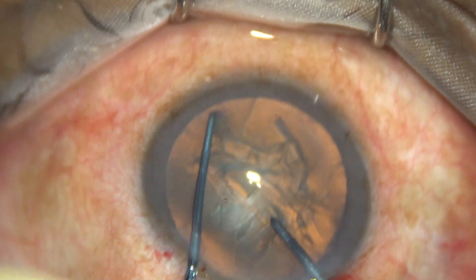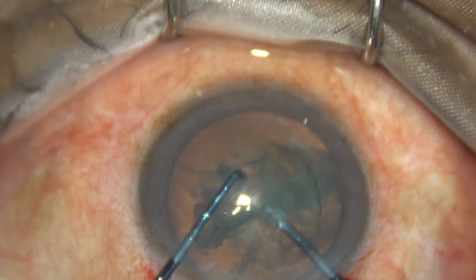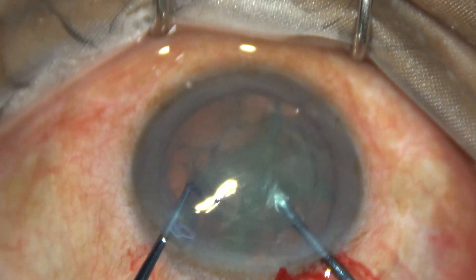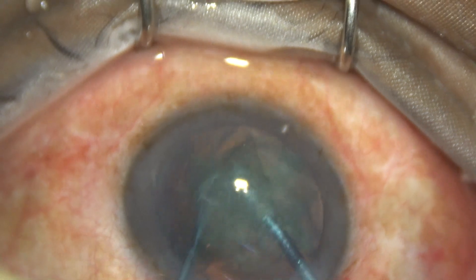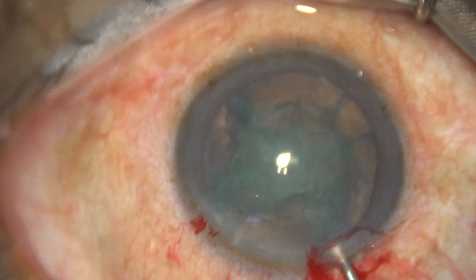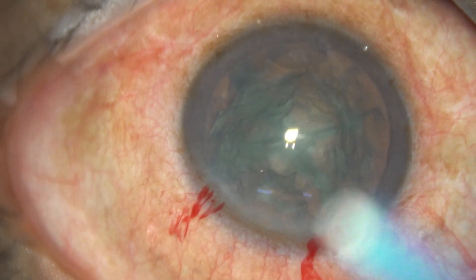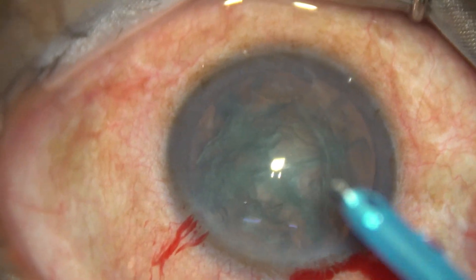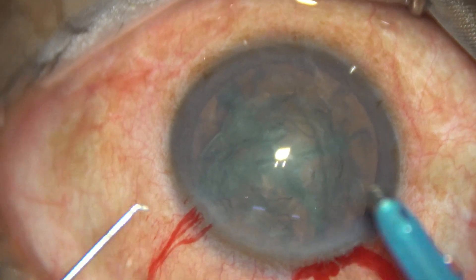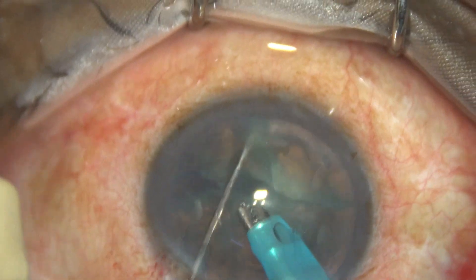The Prechopper is engaged just in front of the main wound in the soft part of the nucleus. The sustainer goes and hooks the opposite equator. The two instruments are brought to each other and the nucleus is divided into fragments. In this video clip we have divided the nucleus into four pieces, but if we just divide into two hemi nuclei and one hemi nucleus is divided into two pieces, that is also okay.